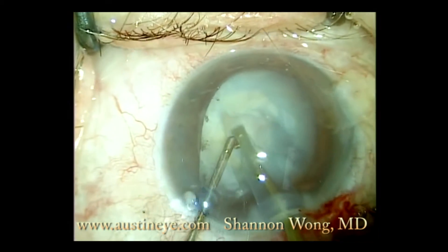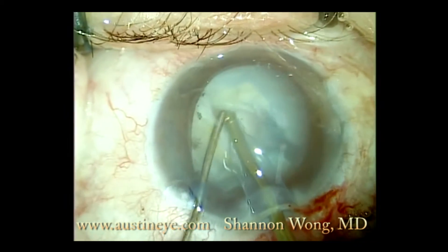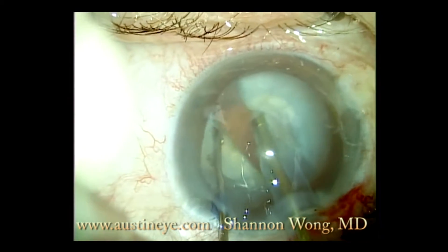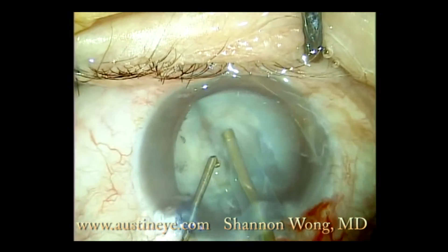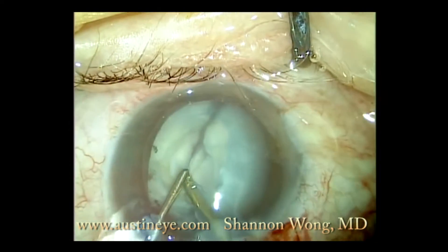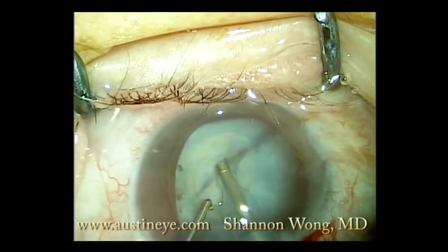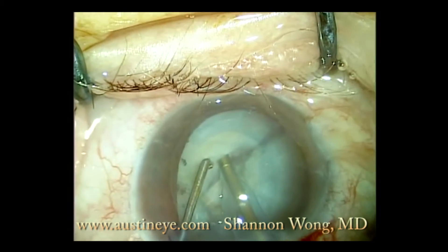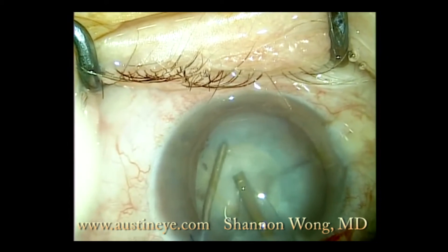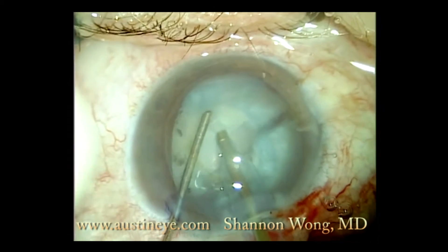So we decided to go ahead and try to phaco this cataract inside the bag — not take out the whole lens and capsule complex, but try to implant a posterior chamber lens. We went ahead and fortunately were able to crack the lens and rotate it, which facilitated our ability to safely remove a substantial portion of this cataract initially. I was basically trying to debulk the very shallow anterior chamber by removing a substantial amount of this very dense white cataract.